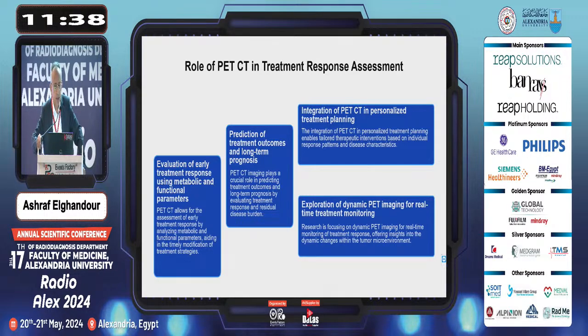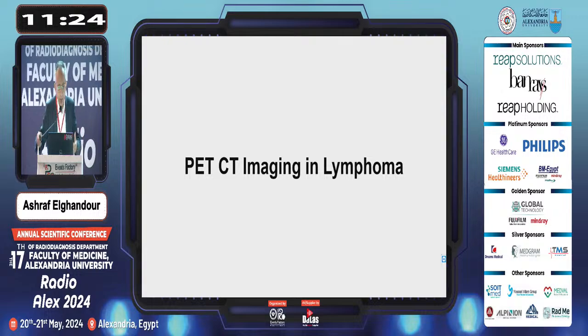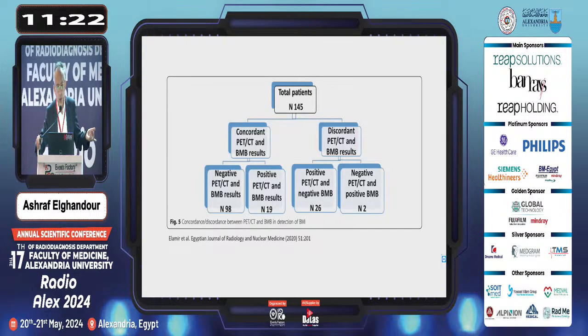Which is very important is integration of PET-CT in personalized treatment planning. What's called personalized, not every patient is the same. You should differentiate between 2 patients in response. This is what we need. This is one of the most important. I have a paper for me.